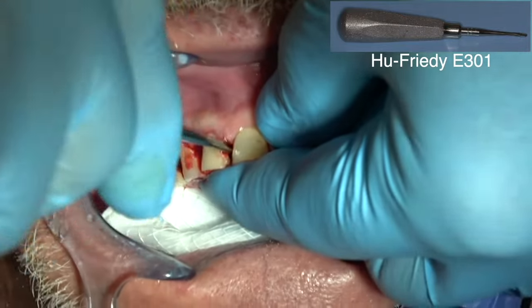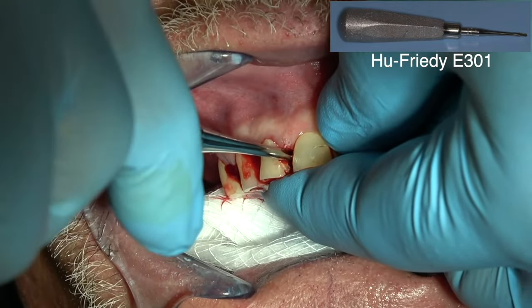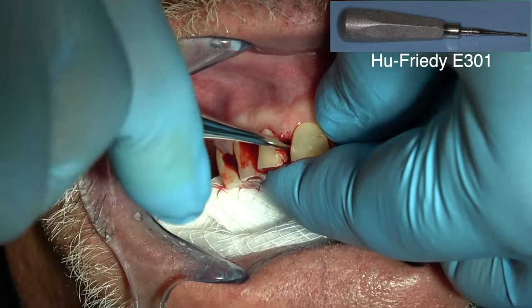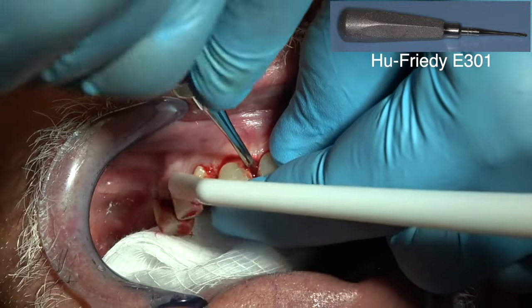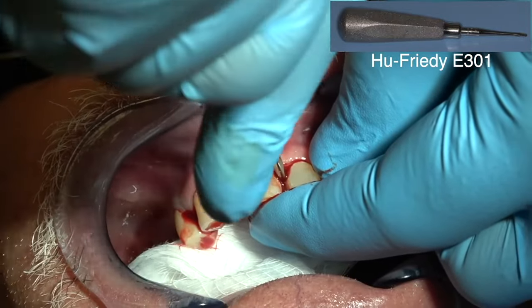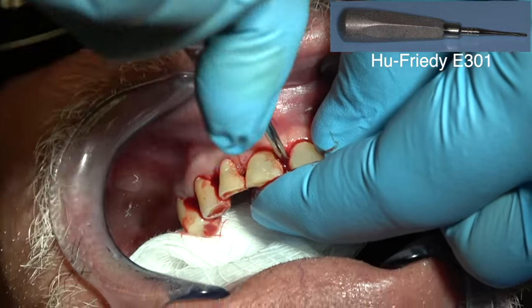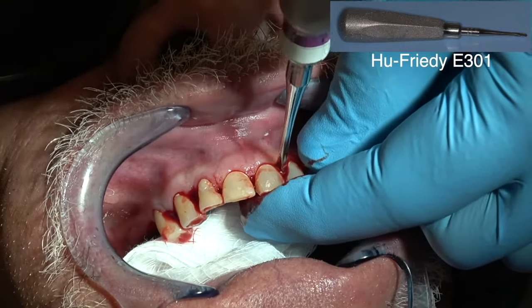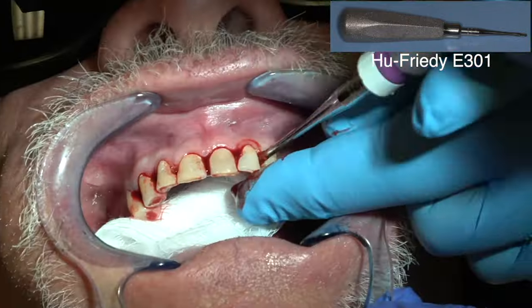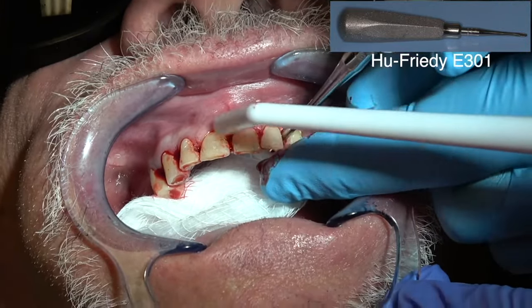This is just a 301 elevator. See the teeth moving — there's periodontal involvement, you can see he's ground them off. So this is worth taking a little time to elevate them before you extract them. When you extract them, you're going to unscrew them and take them straight out of the socket. You don't want to remove them facially because you'll lose the palatal bone, or the facial bone if you can help it.